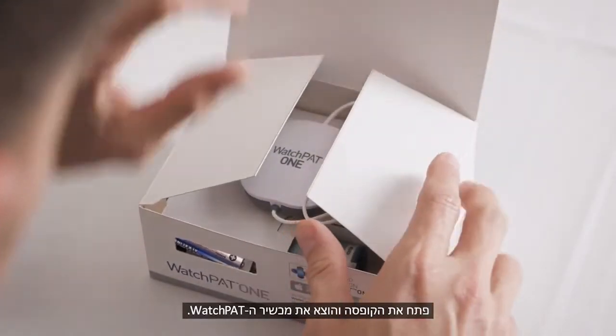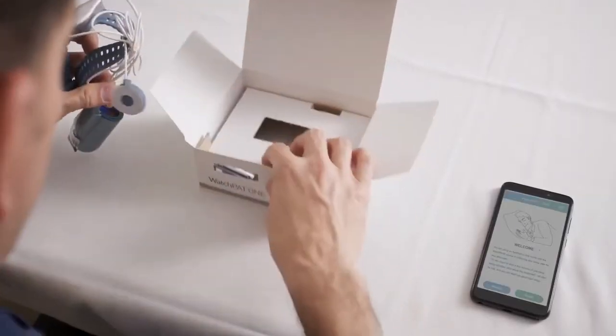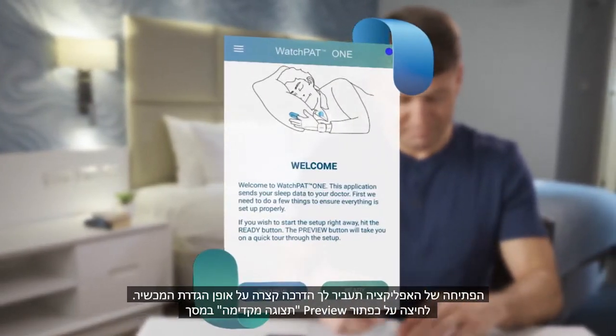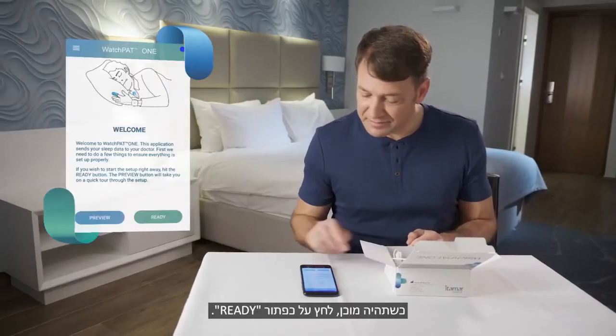Open the box and take out the WatchPat device. Pressing the Preview button on the welcome screen of the app will take you through a short tour about how to set up the device. When you are ready, press the Ready button.